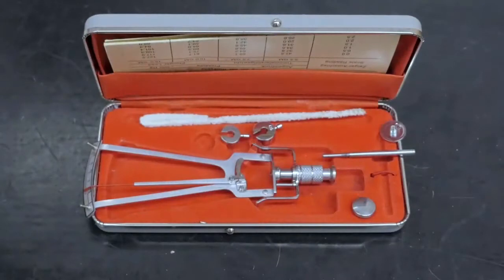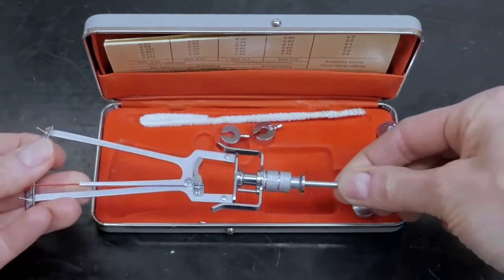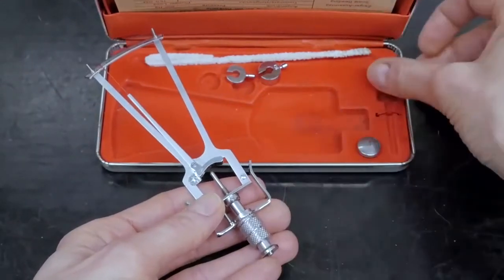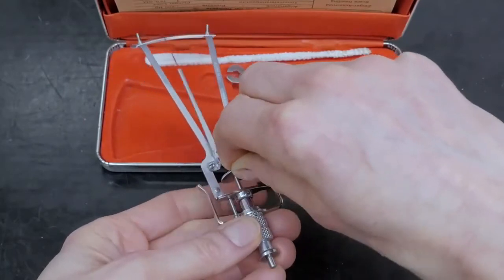Indentation tonometry. This is the form of tonometry that uses the Schiotz tonometer to measure the extent of indentation of the cornea. The Schiotz tonometer is a relatively inexpensive instrument that has 3 main pieces: a threaded pin, a main handpiece with scale, and weights. It is assembled by placing the threaded pin into the cannula of the main handpiece and screwing the 5.5 gram weight plate onto the threaded end of the pin.